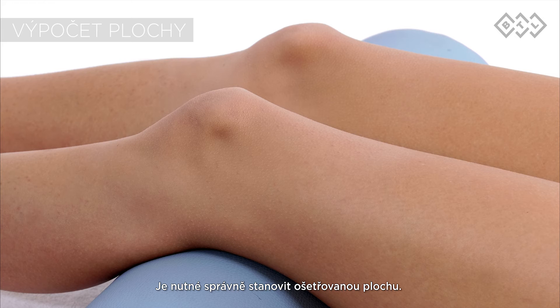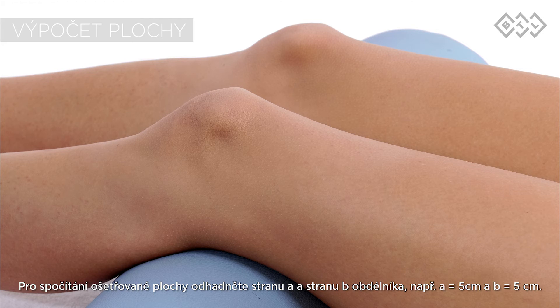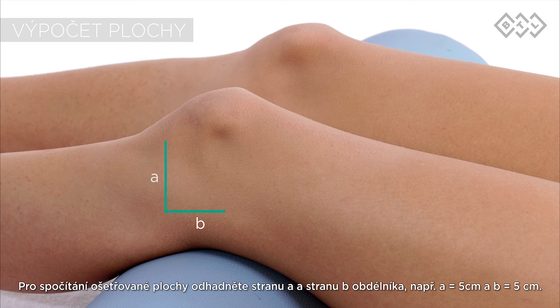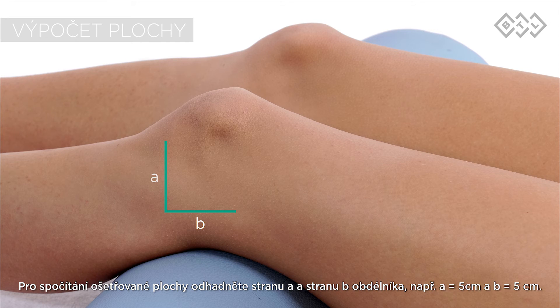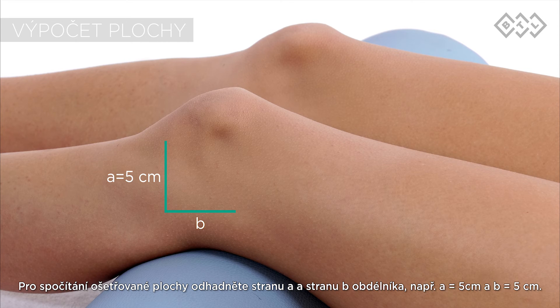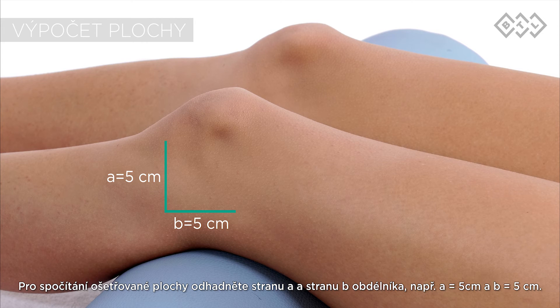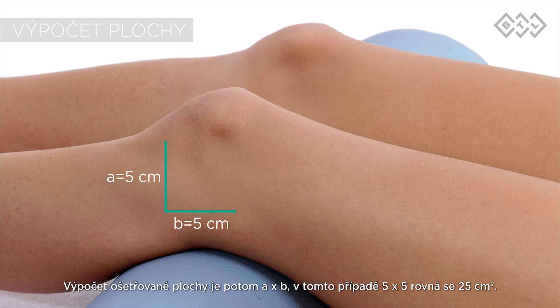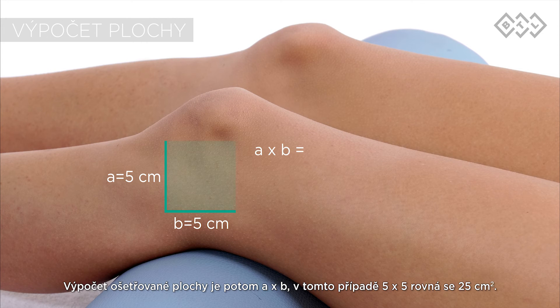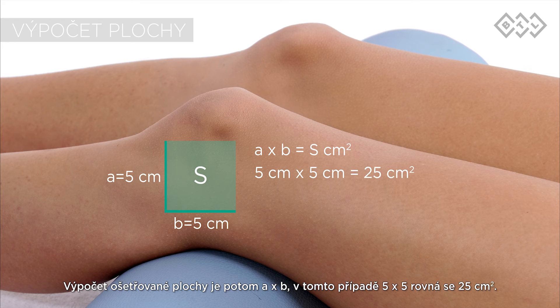It is essential to set a proper treatment area. To calculate the area to be treated, estimate sides A and B of a rectangle. For example, A equals 5 cm and B equals 5 cm. The calculated area to be treated is then A times B — in this case 5 times 5, which is 25 cm².